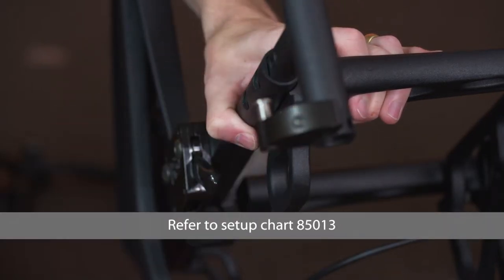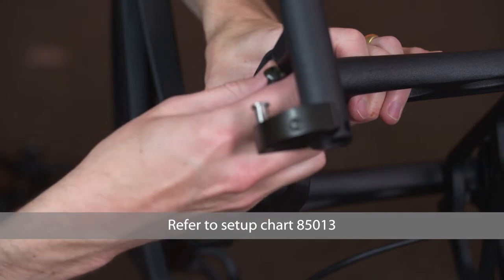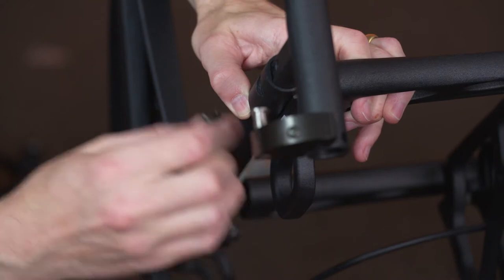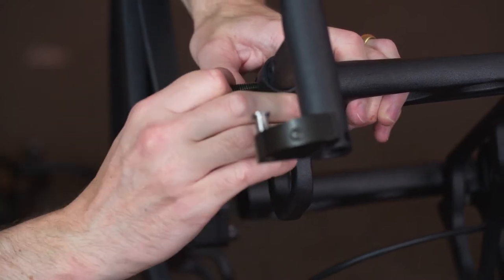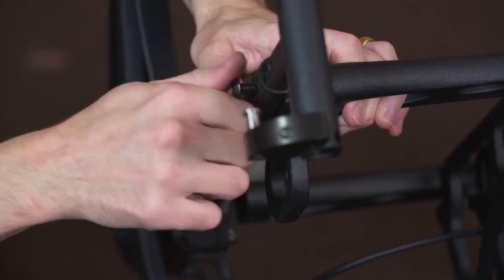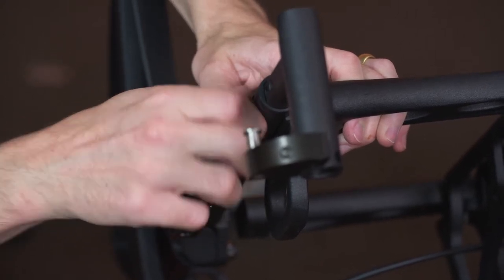Reinstall the front rigging receiver in the original position or refer to setup chart 85013. Loosely install and tighten each of the fasteners by hand.